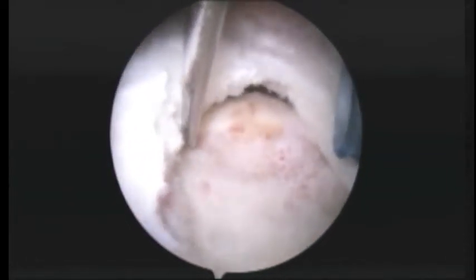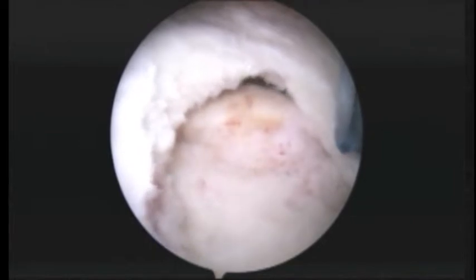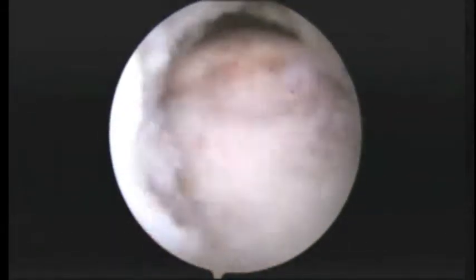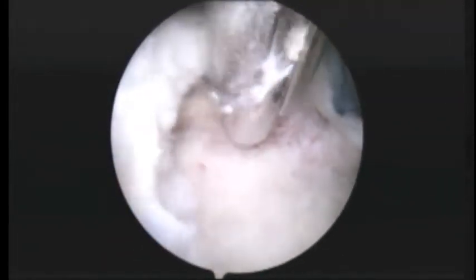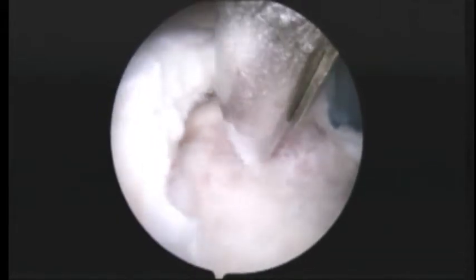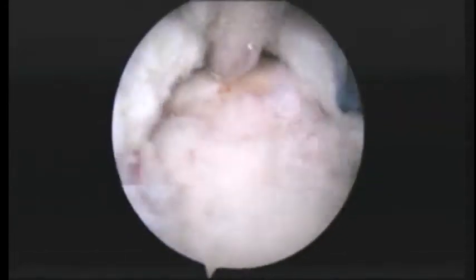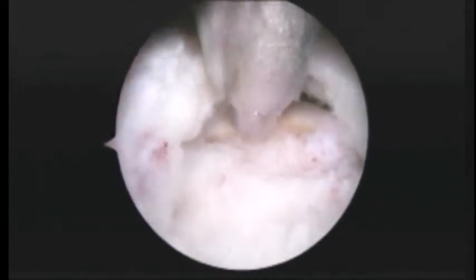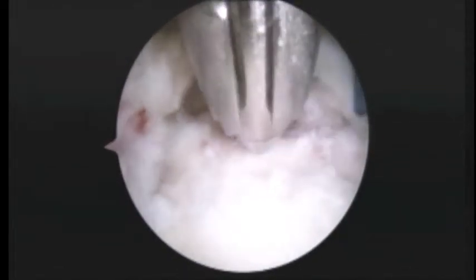So we're going to make a little nick in the skin. I have a free suture. I'm going to put it one side to side. And then we're going to place our guide for our anchor. So there's the guide for our anchor. We're going to place this right where we're level at. There's our picture. And we're going to place this right about here.